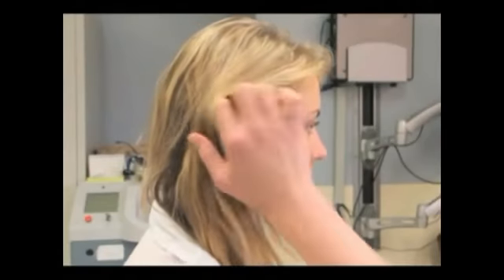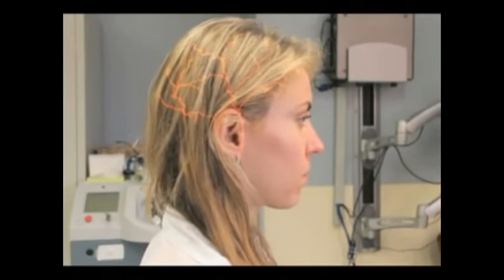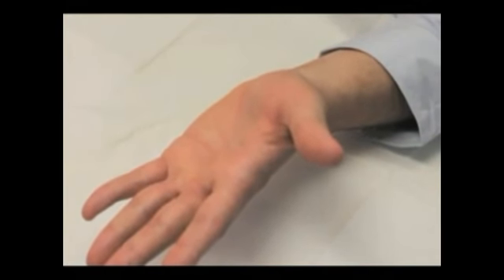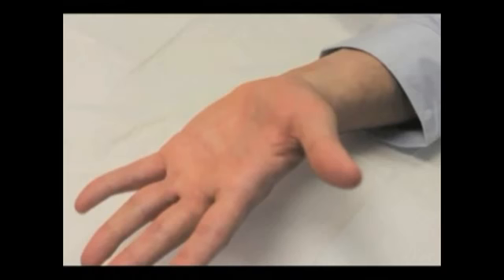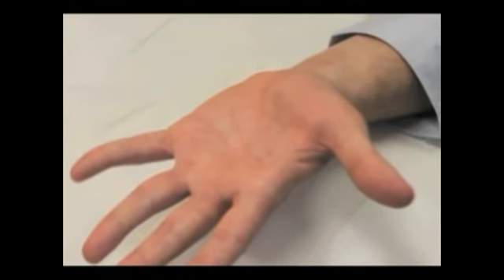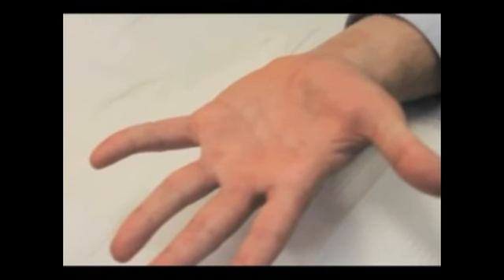Remember the anatomy when performing a punch biopsy so that you avoid damage to major blood vessels and nerves. For example, avoid punching medial and lateral digits and palpate for the temporal artery before biopsying near the temple. When performing a punch biopsy on the palm, for instance, recall that there is very little subcutaneous fat and that once the entire dermis is breached, the instrument is essentially at the level of the fascia. Consequently, do not press hard on the punch.